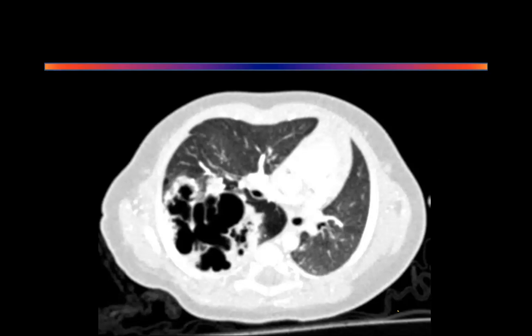Yeah, Jibril, destroyed right lobe. Yeah, secondary to tuberculosis, possible. Yeah, I'm okay with it. You have to give a differential diagnosis, and then you have to do further testing to decide what exactly this is. Okay? So I'm okay with it because you don't know the clinical history at this moment. So because you don't know the clinical history, in an exam, this is what happens.